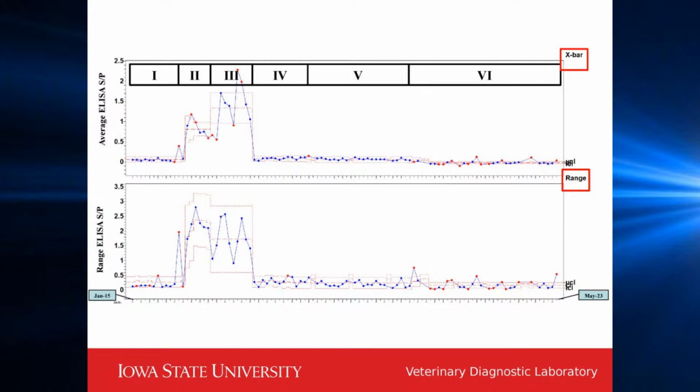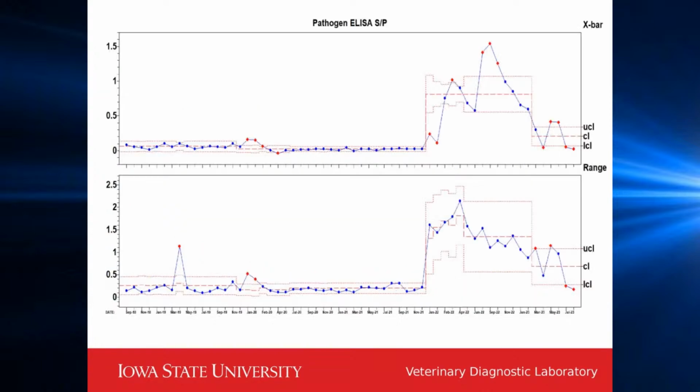So this is another thing that differentiates an infection from a nonspecific reactor. That's the presence of this antibody kinetic curve in the population. And you only get to see that, colleagues, if you have regular collection of surveillance samples and then regular analysis and charting of those sample test results.